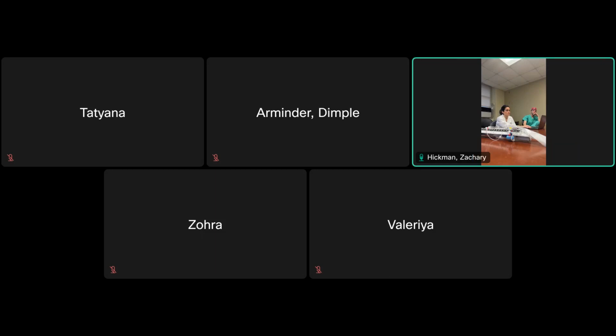But hemorrhage, obviously, tract hemorrhage is another, and then infection is the other. And those numbers vary wildly when you look at different literature, depending upon, for instance with hemorrhage, whether they are getting a scan right after the EVD on every single patient. Are they counting every corpuscle of blood that they can see, or only over a certain volume, like over 5 milliliters?